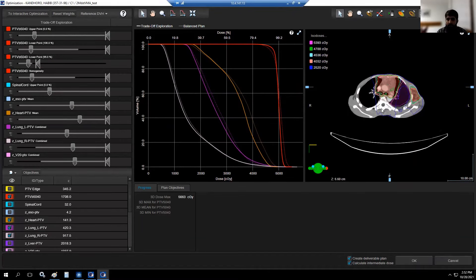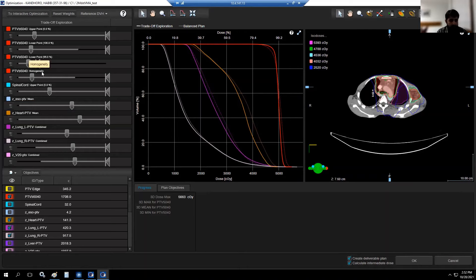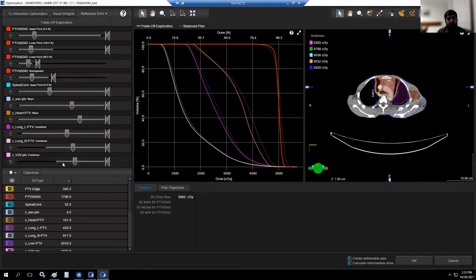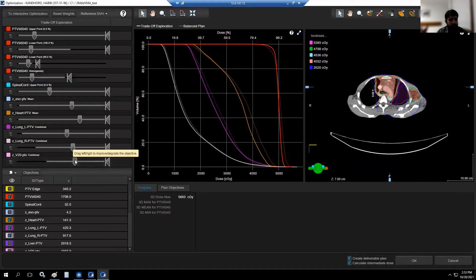You can see this visually on both windows — the DVH and also on the transverse plane — and you can navigate slice by slice to see what happens on each. Now I want to improve the homogeneity of the PTV as well, so I'll move this slider and check the limit. You can see the V20 is reducing. If I want a better V20, then I have to compensate on the homogeneity.